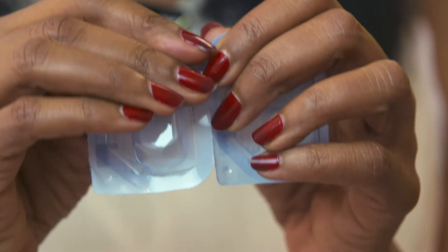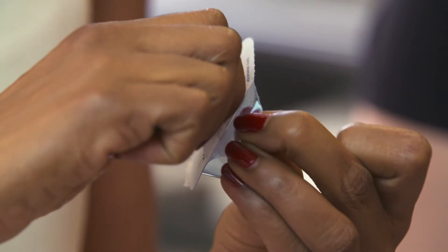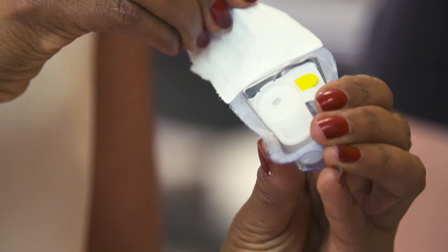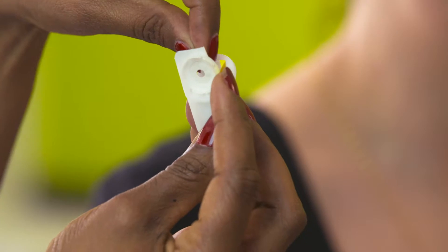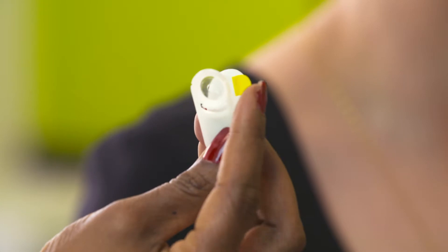This is the ear attachment clip — we've given you two in case you have problems with the first one. You peel back the white paper to remove the clip. The clip consists of some opaque tabs, a sheet of white rectangular paper, and a yellow tab. Holding the opaque clip and pushing back the yellow tab, I'm going to peel the white rectangular paper off, leaving the yellow tab in place. I'm now going to attach the clip to Amna's ear.